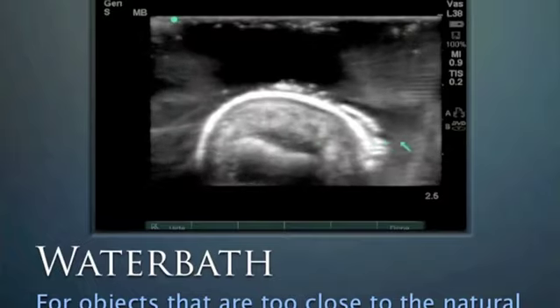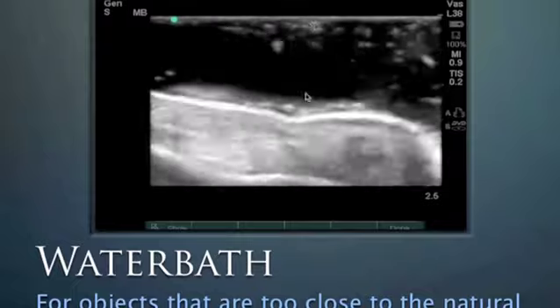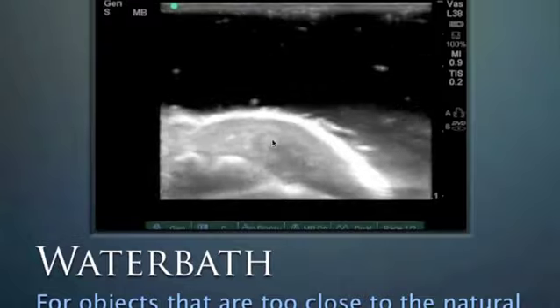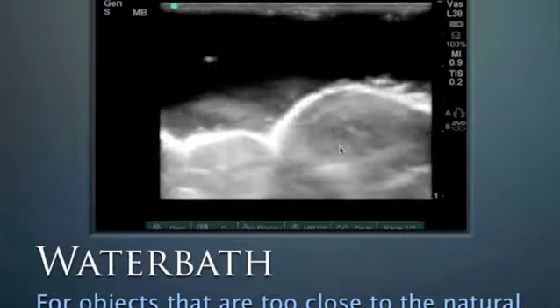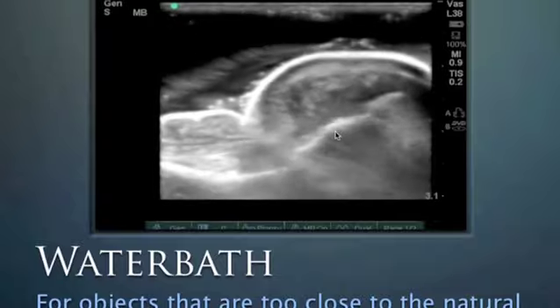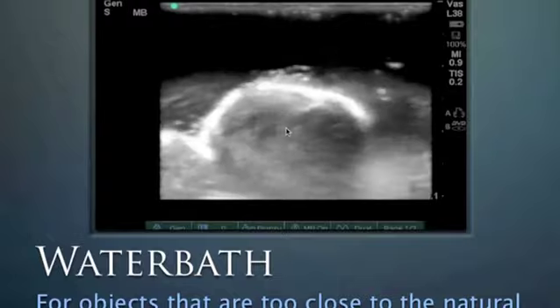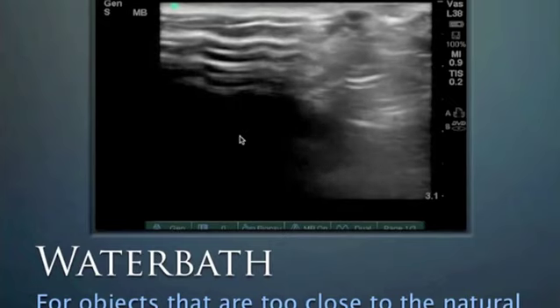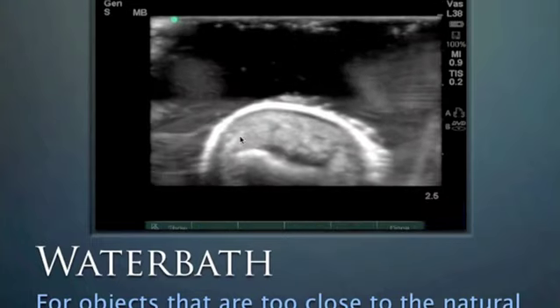This is another example of a finger, and now with the water bath, we stand away from this finger a little bit, and we can see this patient has an abscess here in the distal tip of their finger, and see it quite well with the ultrasound. The patient's moving their finger, we can see it. This happens to be the thumb, and we can see this area of hypoechoic debris in here within the pulpy area of the thumb. Much easier to see when using the water bath.